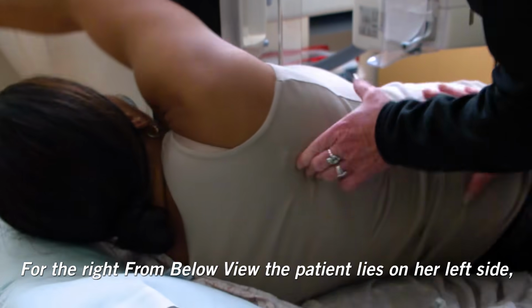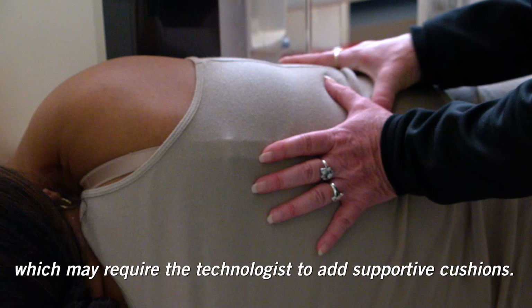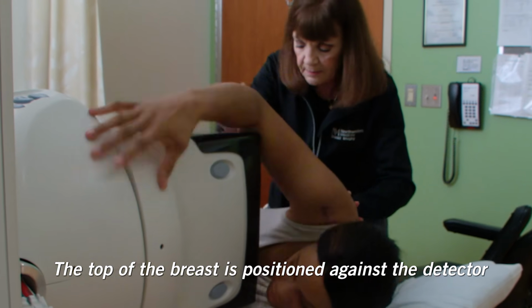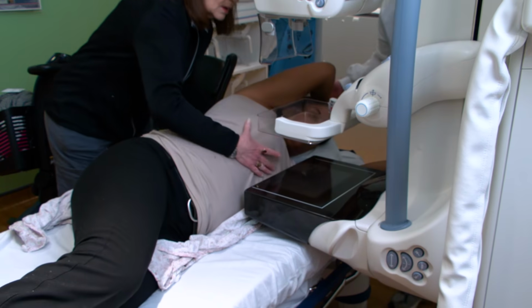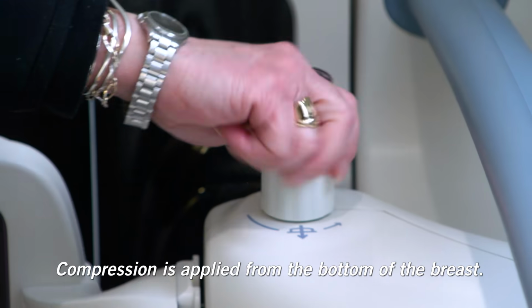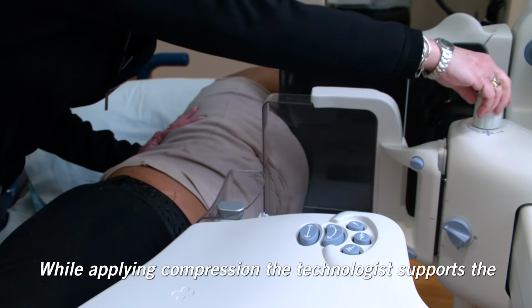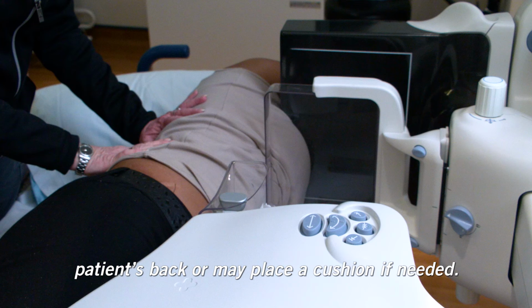For the right from below view, the patient lies on her left side, which may require the technologist to add supportive cushions. The top of the breast is positioned against the detector as the patient reaches with her right arm to rest on the machine. The technologist then lifts and massages the inferior portion of the breast forward to maximize the amount of tissue imaged. Compression is applied from the bottom of the breast. While applying compression, the technologist supports the patient's back or may place a cushion if needed.